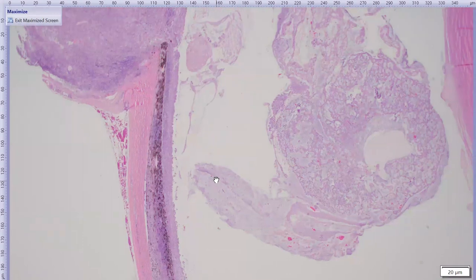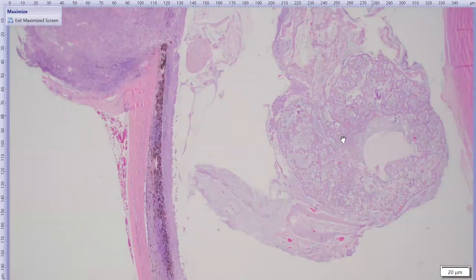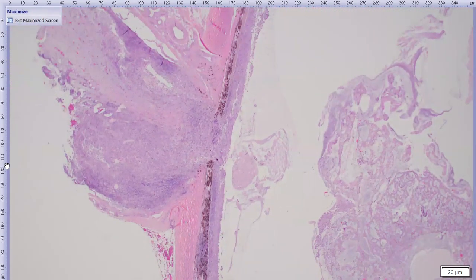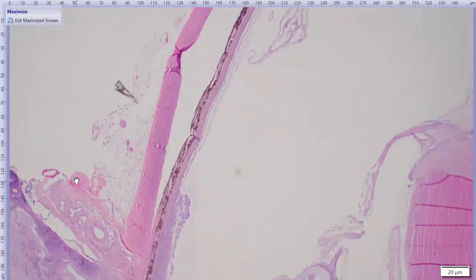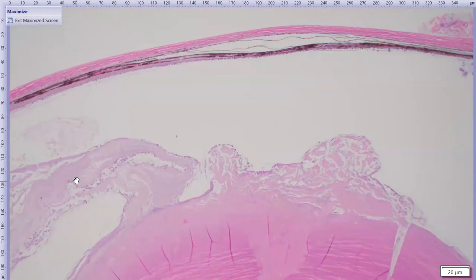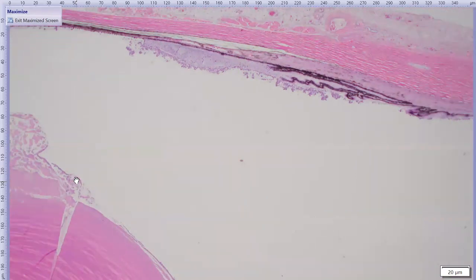And then this ball of tissue that looked like our second sort of translucent structure in the back of the globe here, which is these sort of anastomosing trabeculae of something with a background of something more loose and pale staining, and we'll come back to that again. The optic nerve also is rather too purple, and that purple extends to the edges. And we'll just complete our tour going all the way around, hopefully not making anyone ill.